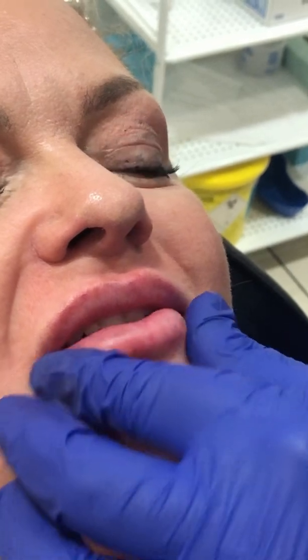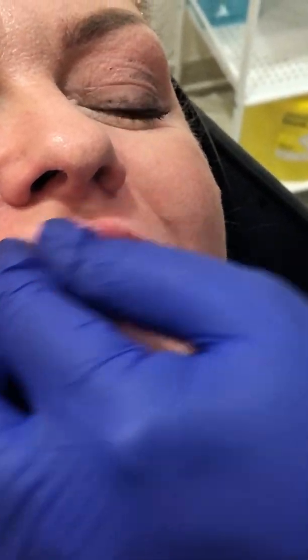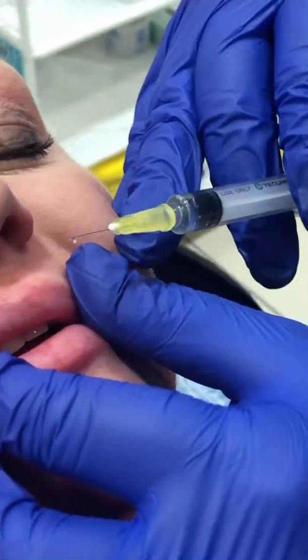Just massaging it around — I'm going to pop some more in. There's slightly more on this side, it was overfilled on that side. I think it's all pretty much gone on this side now. I can just see where the shape of it was on the cupid's bow but it's nearly all gone. I'll do a couple more injections — I'll do the cupid's bow first.